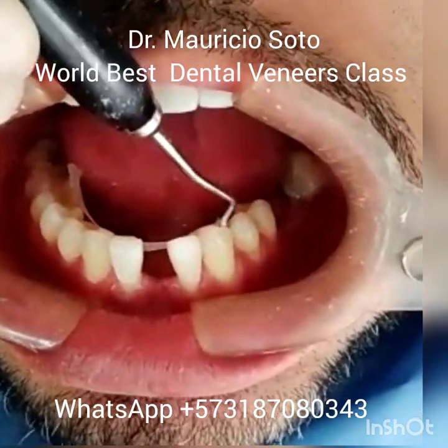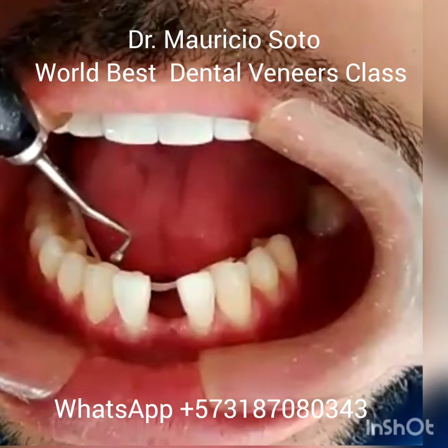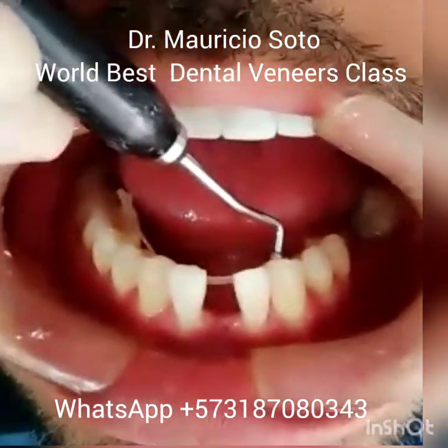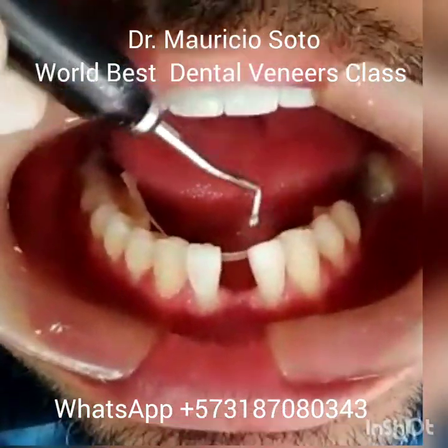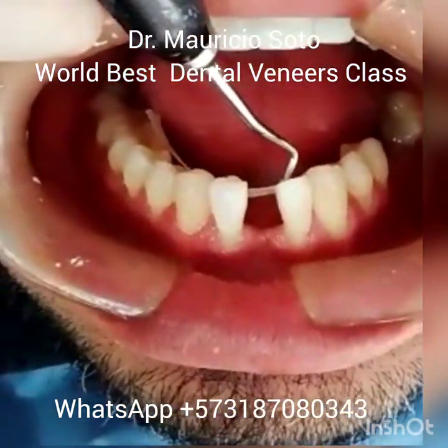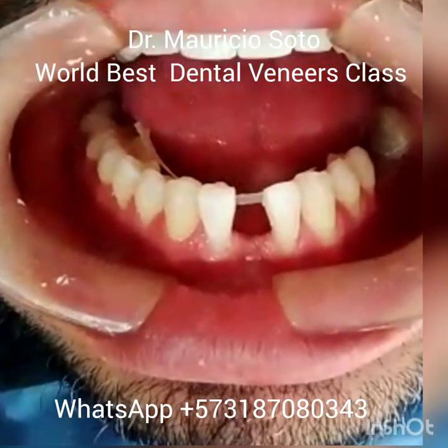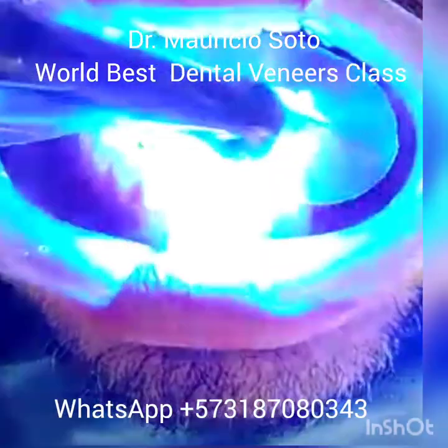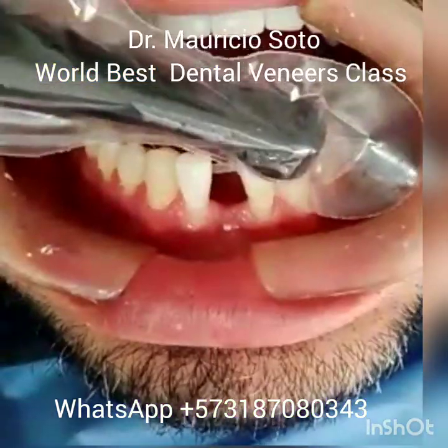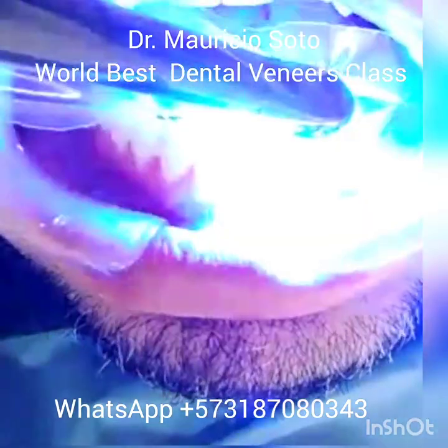To prove the fiberglass, I put balls of composite behind the teeth that support the bridge — the temporary bridge. Now you see how I adjust the fiberglass to support the denture tooth and place it in the missing tooth space. You can see the fiberglass. When you have the fiberglass ready, put the photocuring light to bond the fiberglass to support the denture tooth.